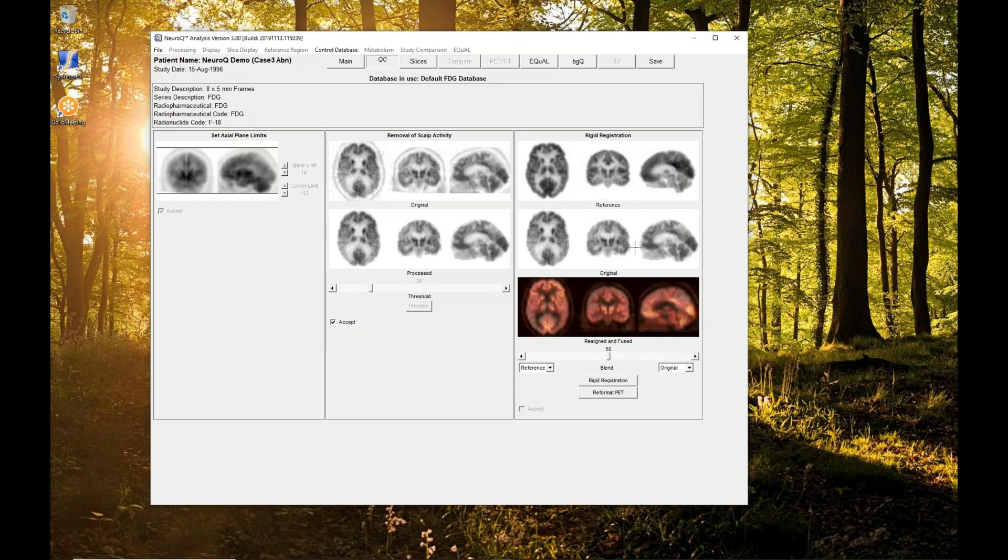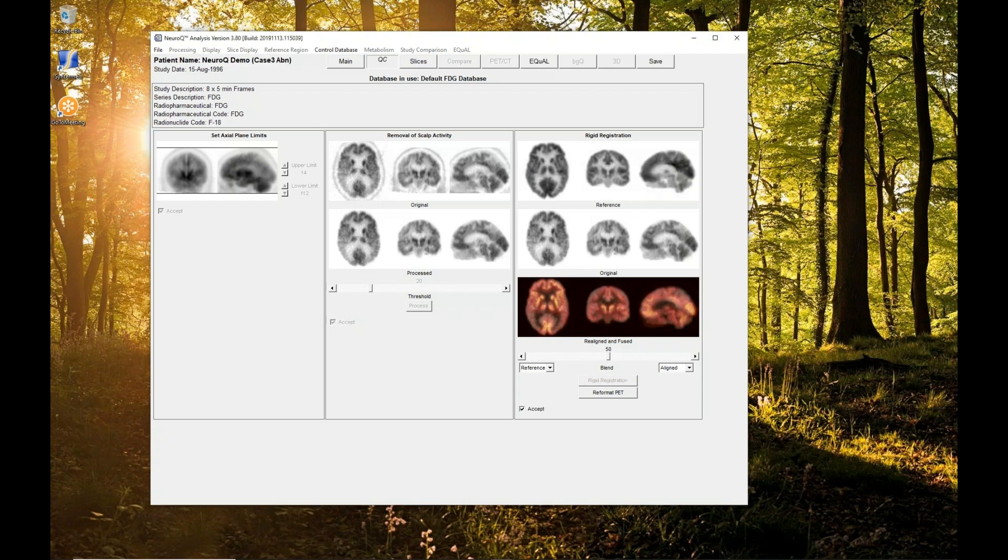Then we want to do a rigid registration. That accounts for any head tilt in the scanner compared to the way our actual template was acquired and reoriented.